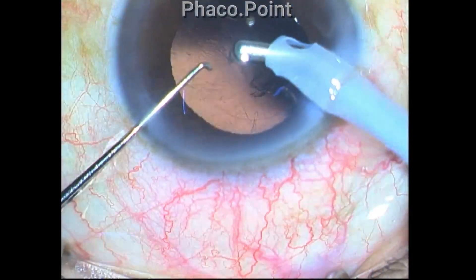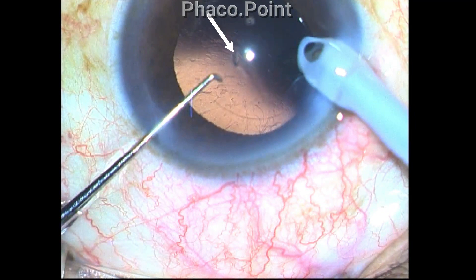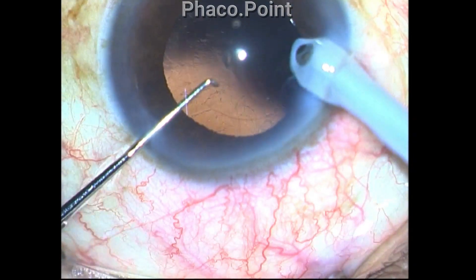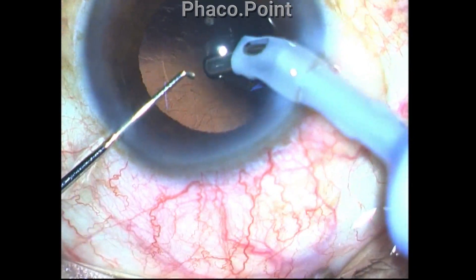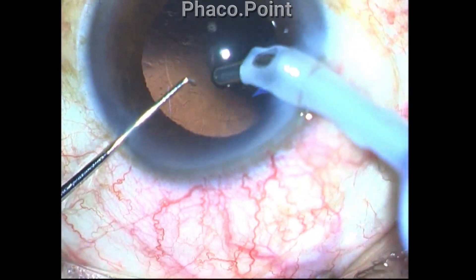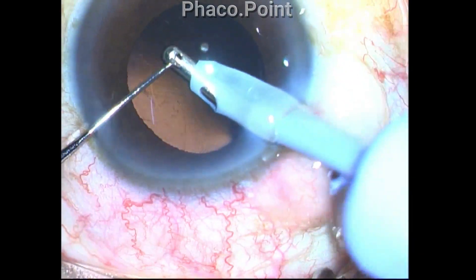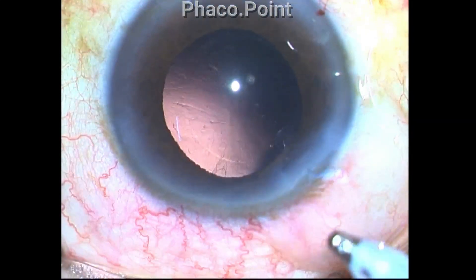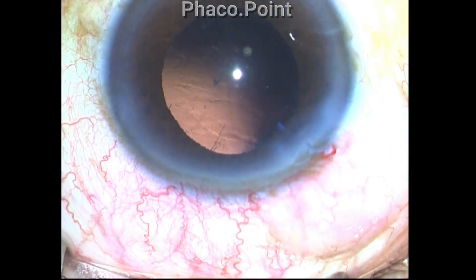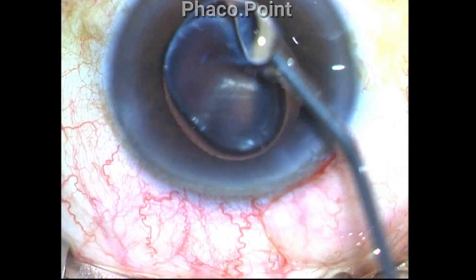Upon doing this, I immediately release or activate the reflux button, which lets go of the posterior capsule, and I immediately notice that a little bit of lens matter has got into the Berger space. The most likely turn of events was that the catching of the posterior capsule pulled it upwards, breaching the weaker ligament that protects the Berger space, therefore allowing free access of the lens matter to reach the Berger space.